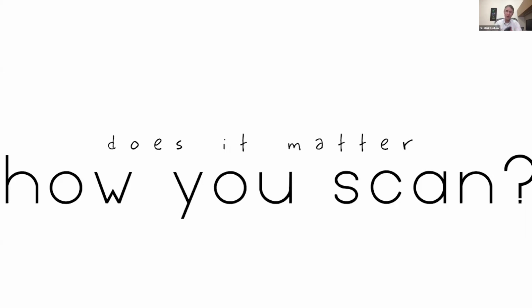It's just like your phone. We get new iPhones or get new whatever. The cameras get better and better and better because of the processor and the megapixels and different things like that. And that's one aspect of it. But the other aspect of it is called algorithmic accuracy. And it is how the 3D models are actually built. And it's built through math. And you've got to give that math the data in a certain way to be able to get the best product out there.